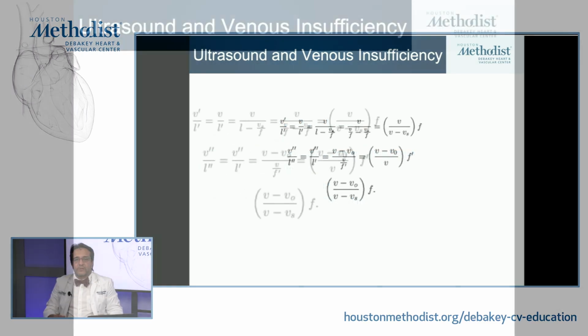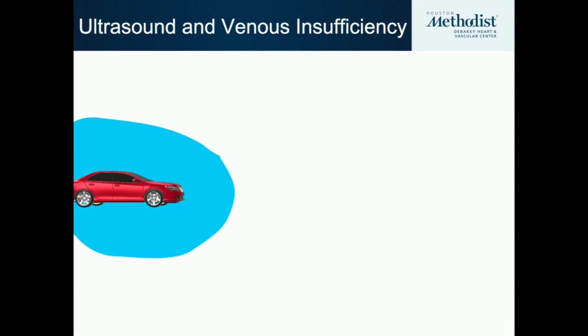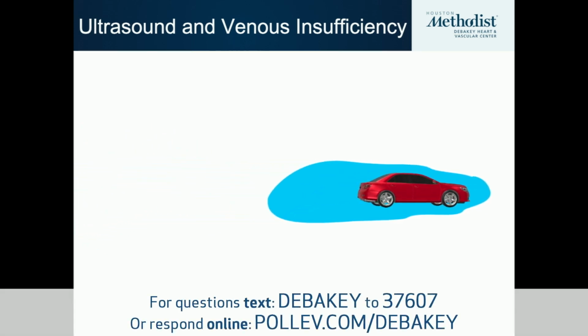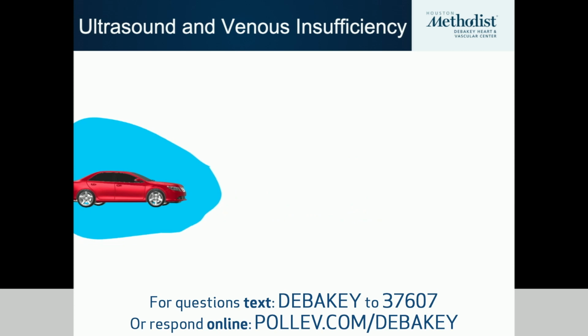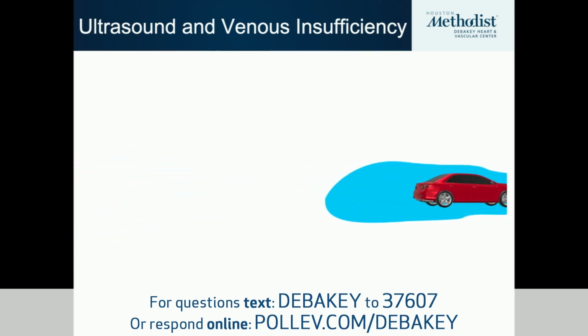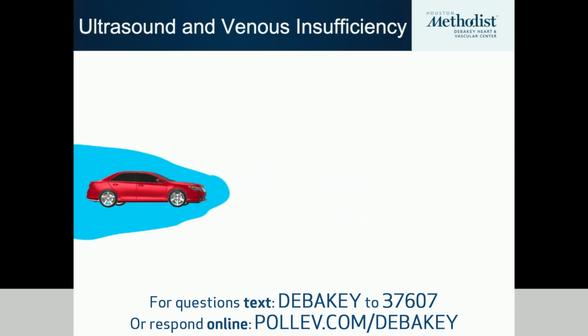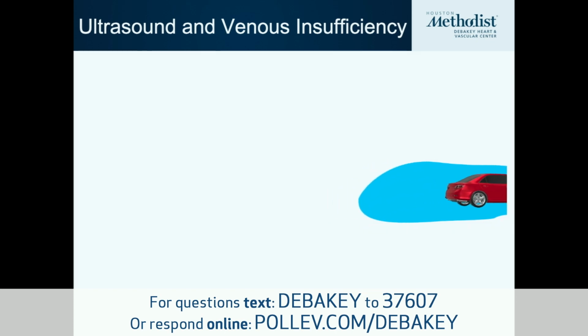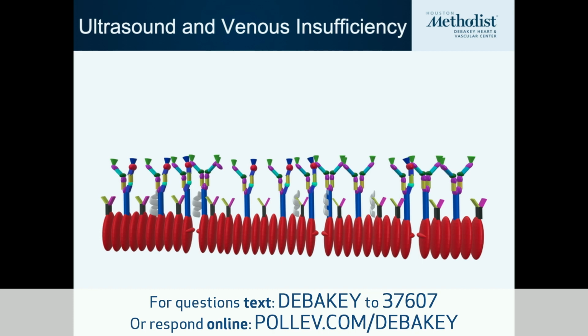The other part that I like to talk about, and don't panic, because I don't even know what that means, is the Doppler effect. In a simple way, the easiest way to understand this is when some object, a car that everybody puts as an example, moves, it's going to compress the air that is going ahead of it and then dissipate the air behind. If you add sound to that, it's going to have the Doppler effect that we are familiar with when an ambulance is coming towards us and then goes away. The sound is different. That is what we use in the blood vessels to see the velocity and the direction in which the blood flow is going.